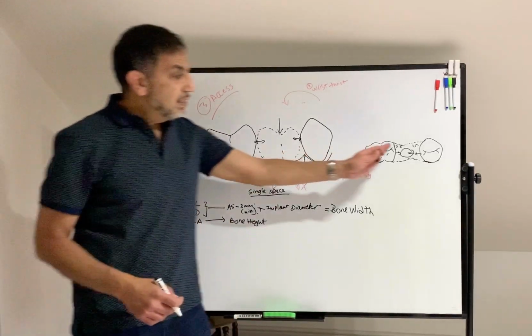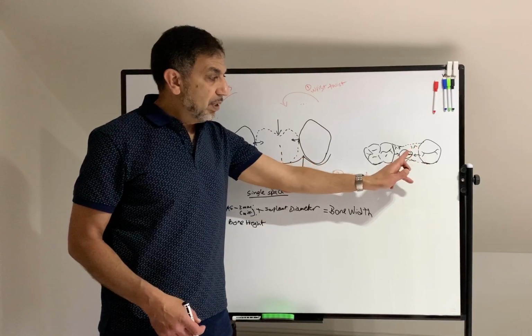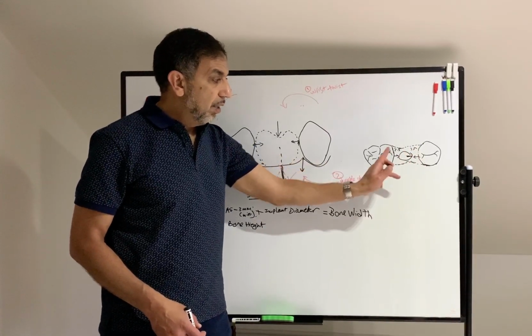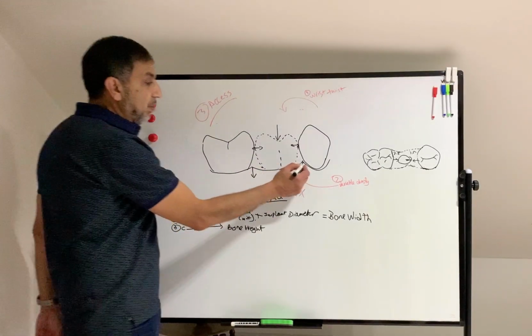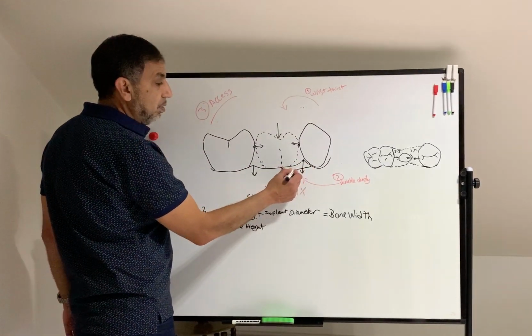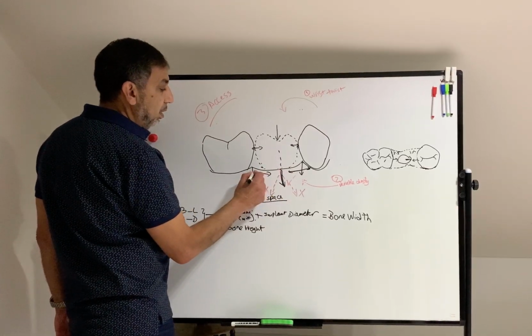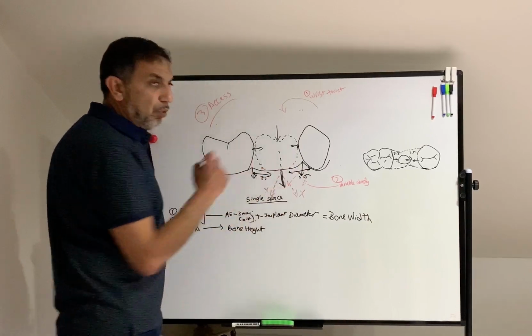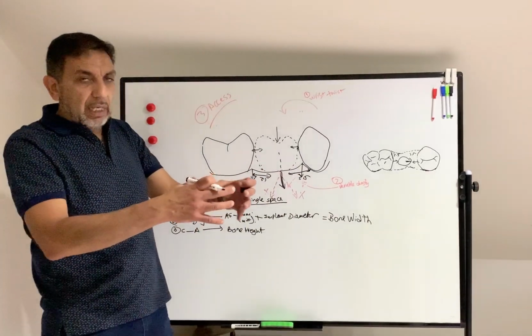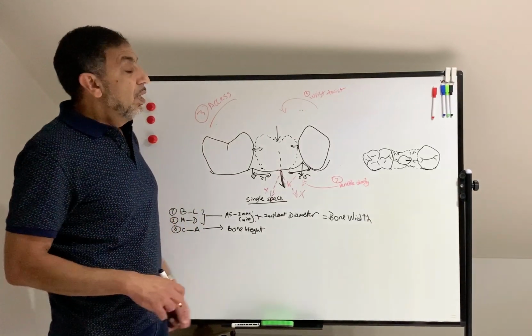So you have to center the implant 3.5 millimeters from here and 3.5 millimeters from there, okay? So you have to have the center point of the implant 3.5 millimeters here and there, 3.5 and 3.5. And that's the center point. And then the osteotomy will enlarge as you enlarge your osteotomy with your drill.